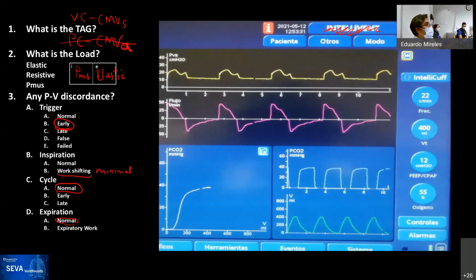And it's certainly disconcerting, but it's just because you're where the proximal flow sensor is at. Does that make sense? So that's why you see the flow increase as the patient does effort, because some of the circuit is crossing through that sensor, and it gives you that image. Rob, disagreements, anger management, slap?